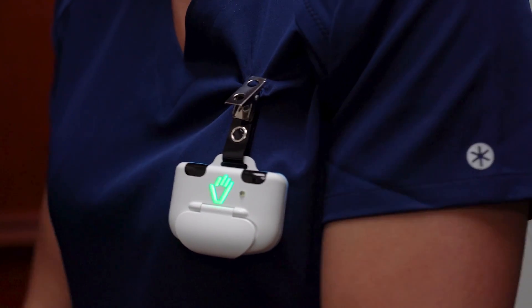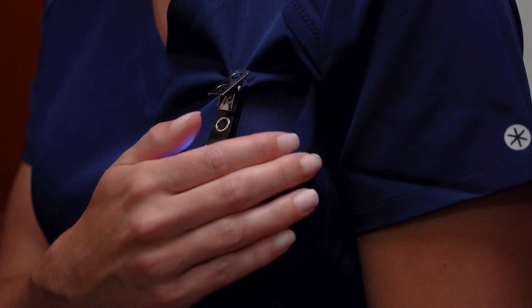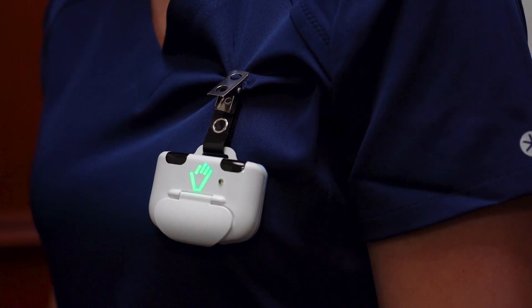Once the sink beacon turns green, the beacon will tell the badge to turn blue. Once the badge turns blue, the user can accept credit for the sink event by tapping the badge, and the badge will turn green.